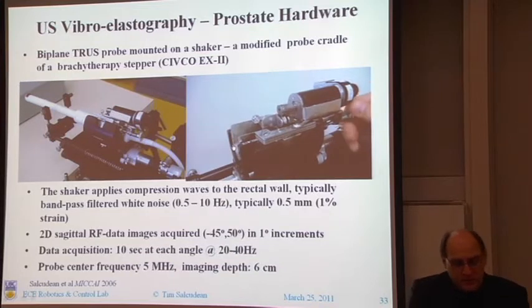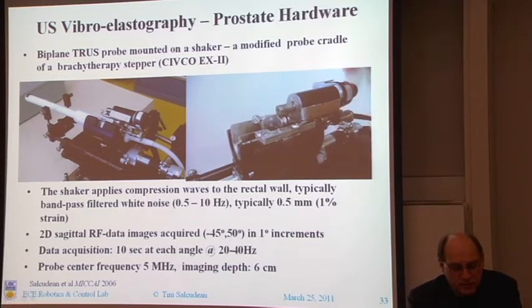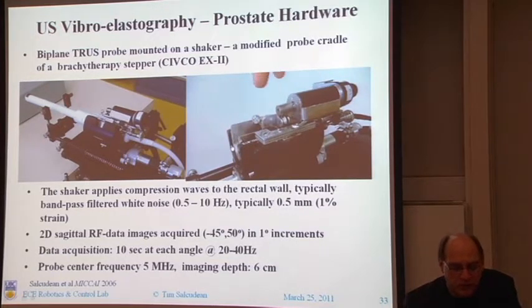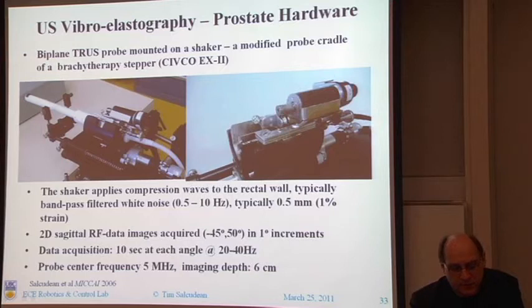The system is used by the radiation oncologist during prostate brachytherapy. You have here a slider which moves a carrier for the transducer. It's spring-loaded, so it's perfectly safe. You have a maximum force that you can apply, and the doctor can stop whenever they want to do that. And this spring-loaded carrier rides on a cam, which you can adjust manually by moving the motor back and forth.